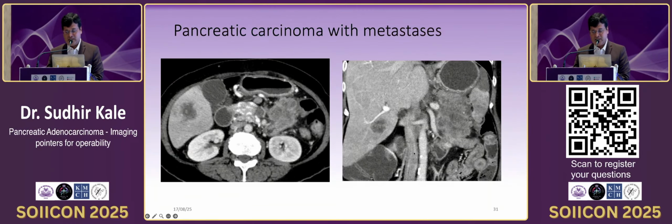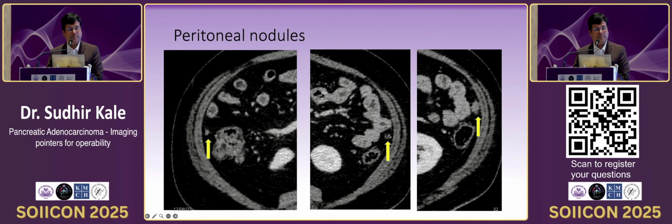And so this is a patient with pancreatic adenocarcinoma with a liver metastasis. So all these findings you need to look for, and also please look into the peritoneum. It doesn't end with this. Peritoneal mets is also a known entity in pancreatic adenocarcinomas. So please look very carefully at the omentum, mesentery. Okay, you can see these nice omental nodules here, right?